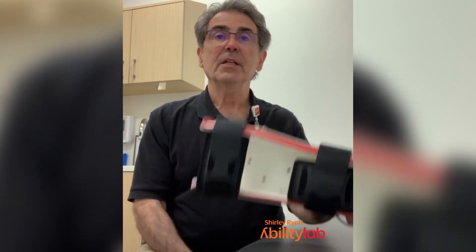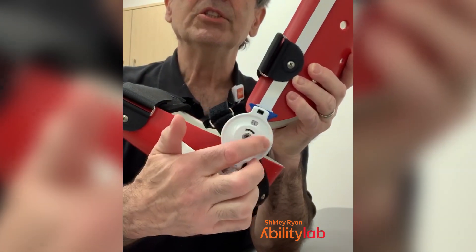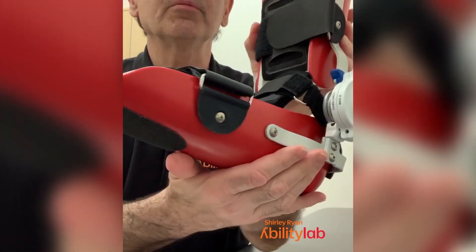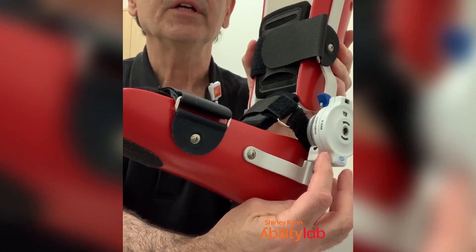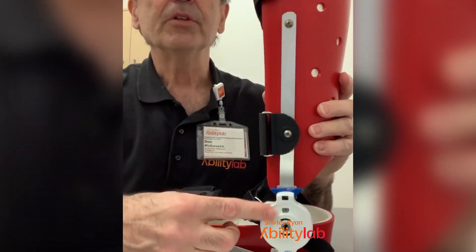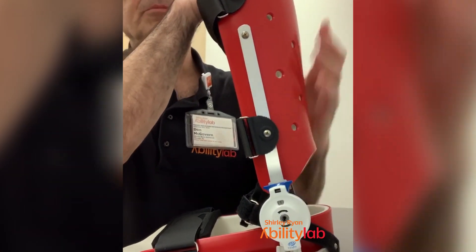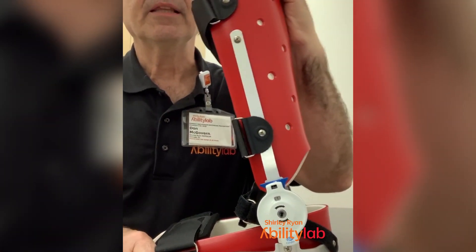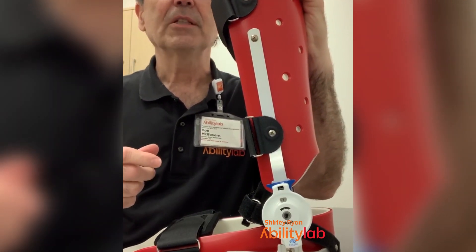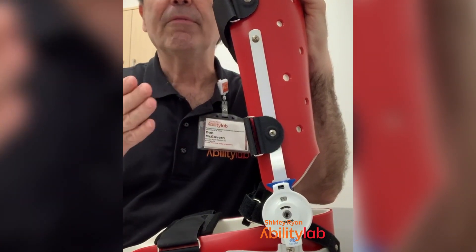The Ultraflex is unique in that it has this joint which has a tension in it. There's a number right there you can see, and we'll show you a little bit later how to adjust it. There's also a lock mechanism that you can see right there — a little padlock on it. When it's down like that, it's locked, and this can make it very easy to put the device on a person so you're not fighting the spring.